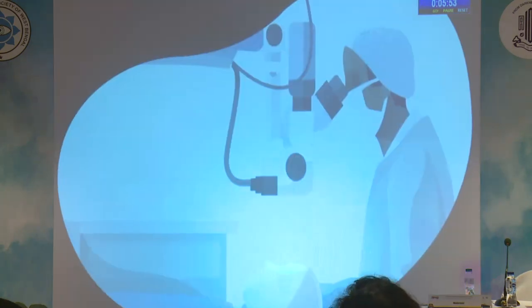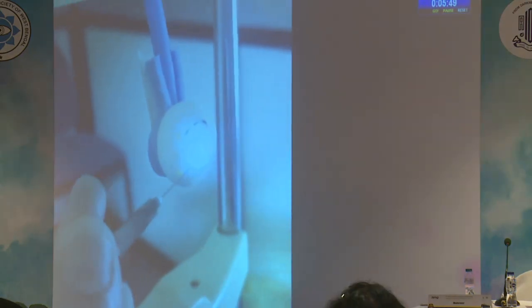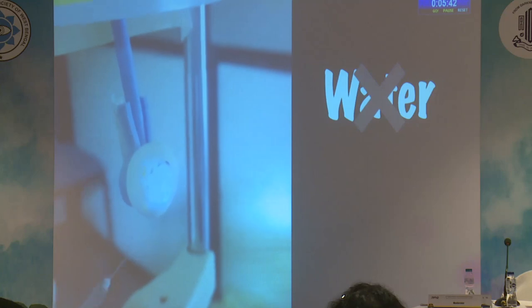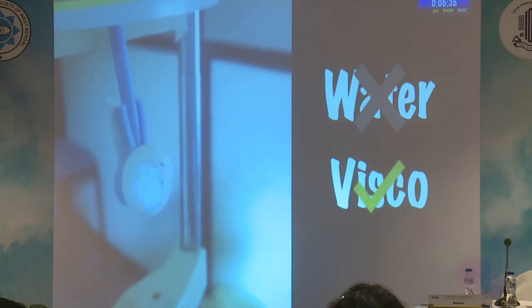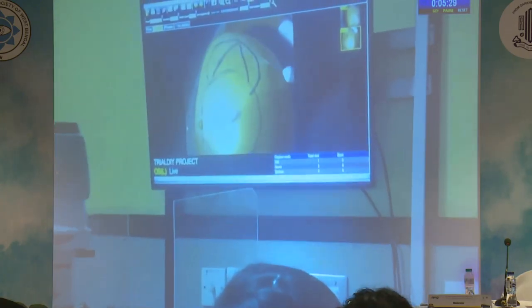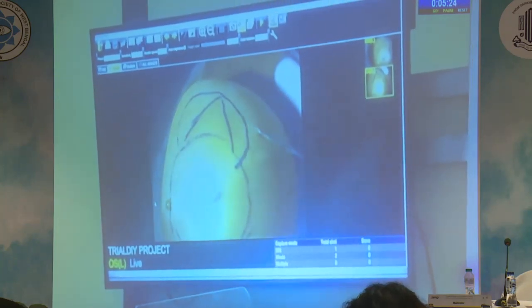So we thought, can we mimic surgical procedures? Then we tried doing AC decompression using a 26 gauge needle. We tested with water, but it collapsed once it was punctured. Next, we filled the glove finger with viscoelastic because it was transparent and at the same time more viscous. Next was bleb needling, for which we used red toothpaste to get the red glow and better visualization. We marked the limbus and scleral flap on the model eyeball and utilized a 26 gauge needle to practice bleb needling. Then we thought, what about lasers?